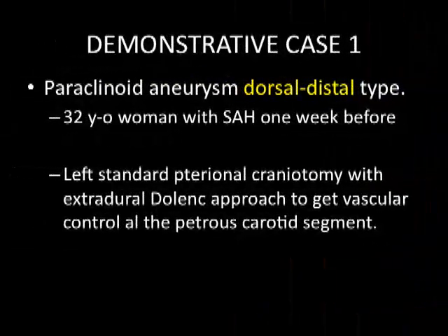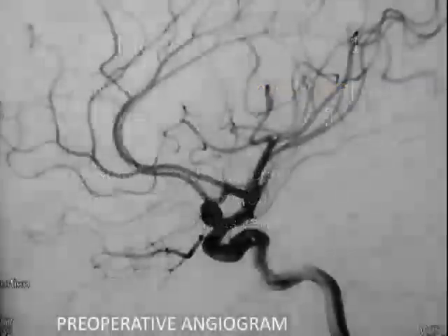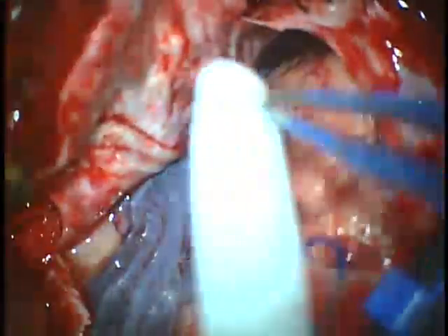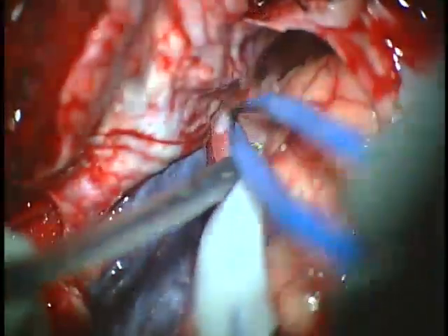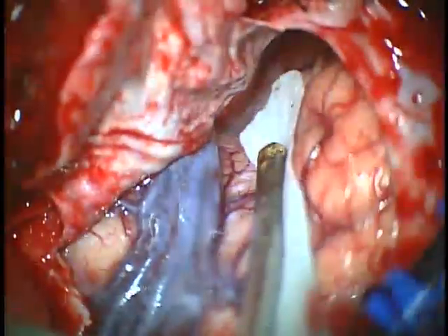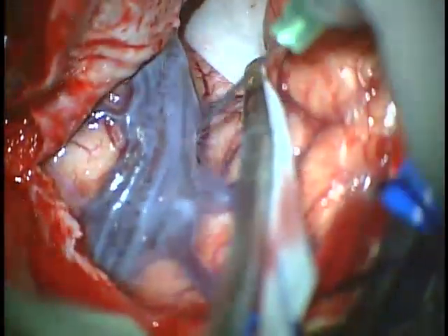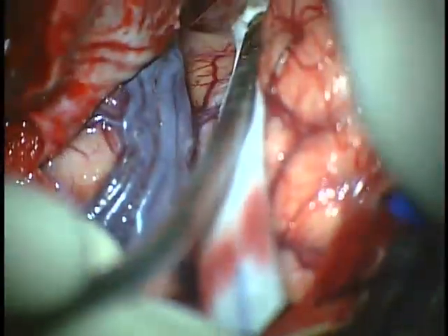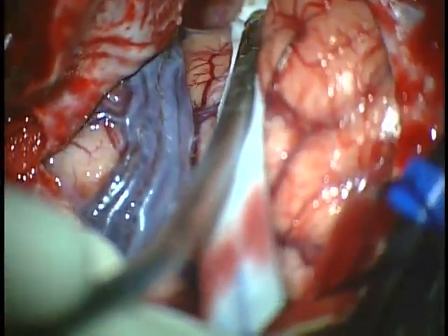In the first demonstrative case, we will show a dorsal distal small aneurysm in a patient with a recent subarachnoid hemorrhage. The dura is opened in a semilunar fashion and the sylvian fissure is split using the hypodermic needle and micro scissors down to the basal cisterns.